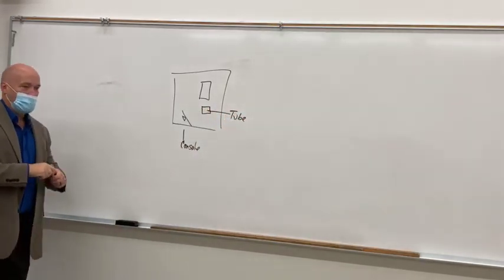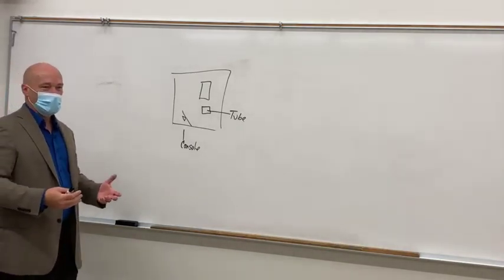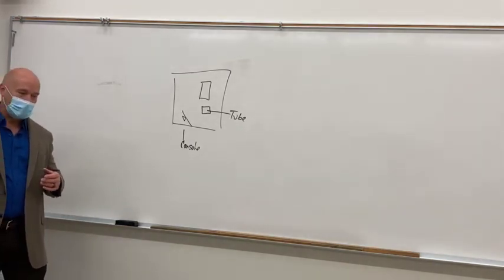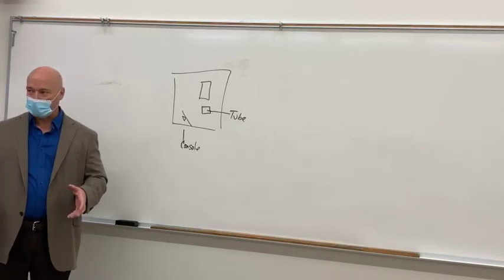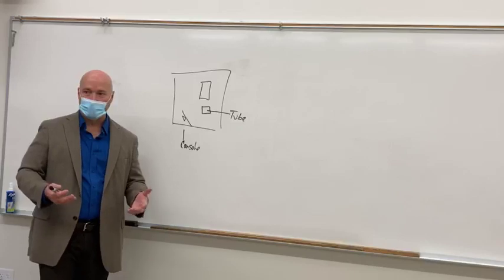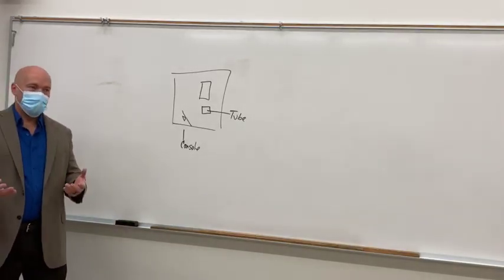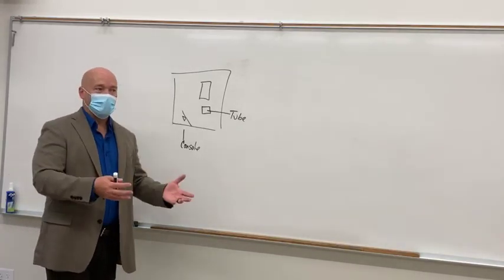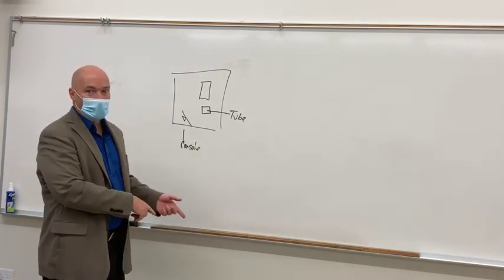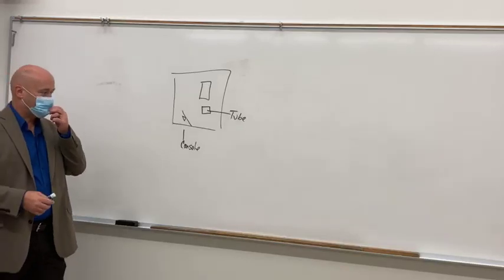And then you've got what the book calls the high voltage generator. It's not really a generator, it generates high voltage, and that's why they call it a generator. The definition of a generator is something that generates electricity. It doesn't generate electricity, it manipulates electricity. I know it's kind of splitting hairs, but I think it's important to understand why they're calling it a generator. You're generating high voltage from low voltage, but you're not really generating electricity, okay?